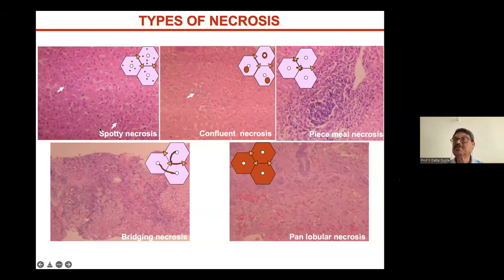So these are the different patterns. A cell can be large, mainly because of hydropic change. When it's ballooning degeneration, it can be clear in cholestasis. It can be clear in glycogen storage disease. It can be clear when there is fat in the cells. Now let's come to the necrosis we are talking about.